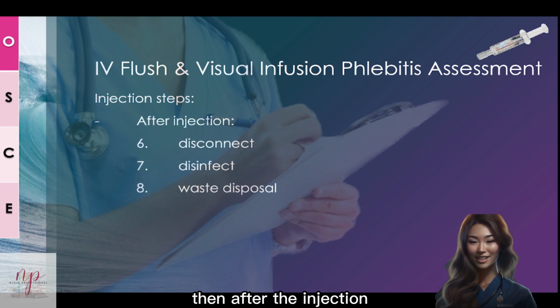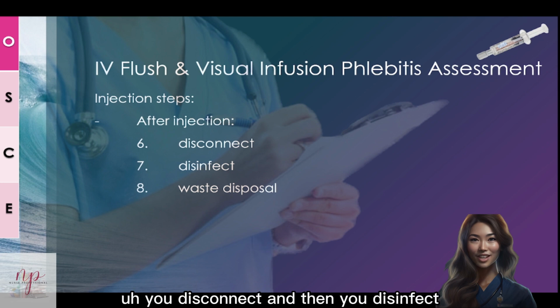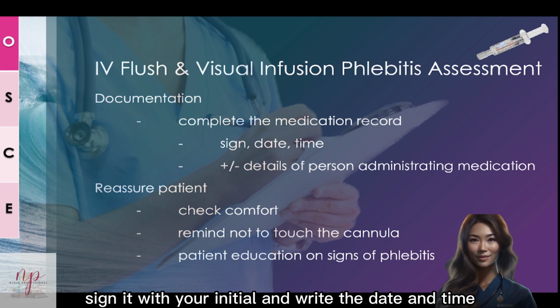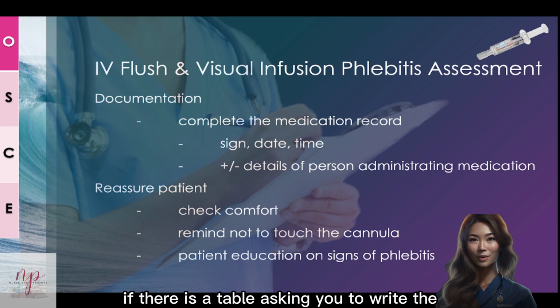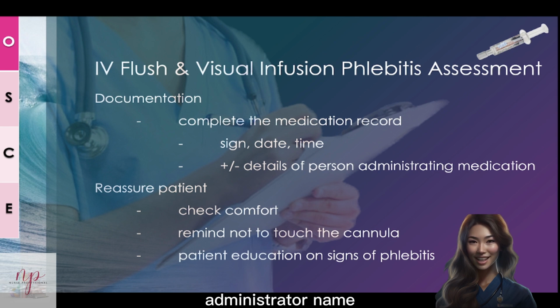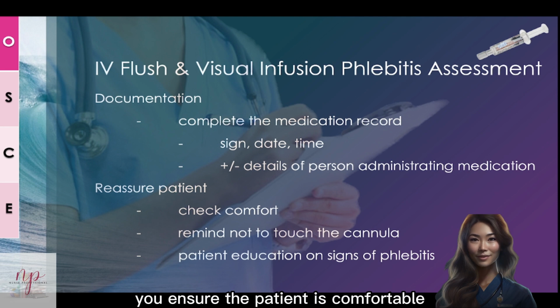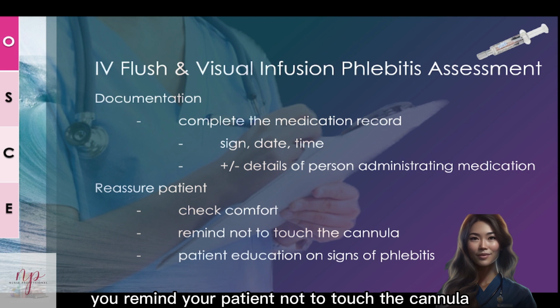And then after the injection, you disconnect, and then you disinfect, and then also you do the waste disposal, followed by hand hygiene. Quickly document your medical record, sign it with your initial, and then write the date and time. If there is a table asking you to write the administrator name, remember to write it. After that, you reassure your patients, you ensure the patient is comfortable after the procedure, and also you remind your patients not to touch the cannula.